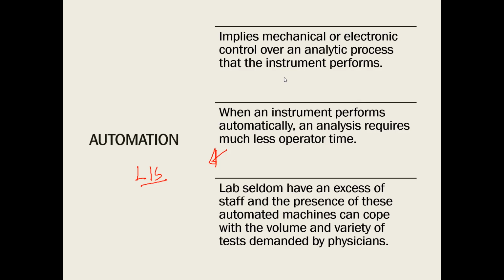That is why one purpose of our automation is to shorten the turnaround time, because we just have to load it in the machine and let the machine do it. But I always keep on telling and saying that we must be able to correlate the results of the test even if they come from the machine.